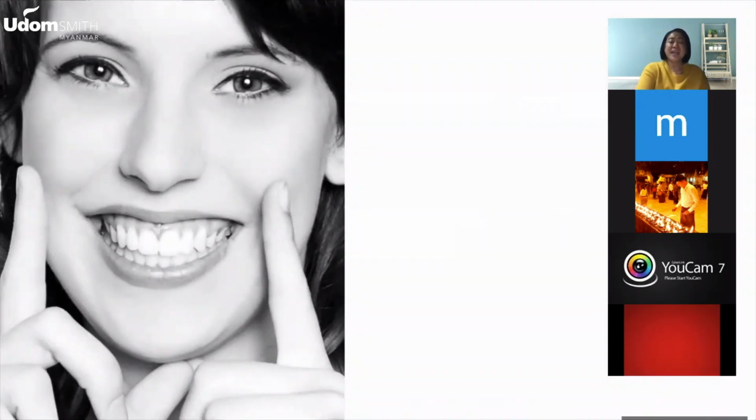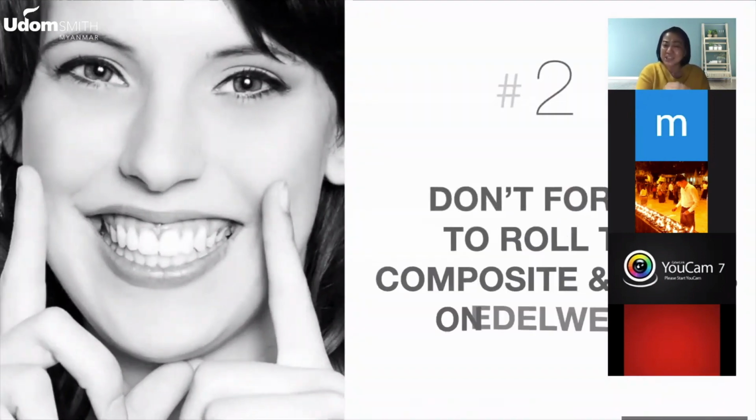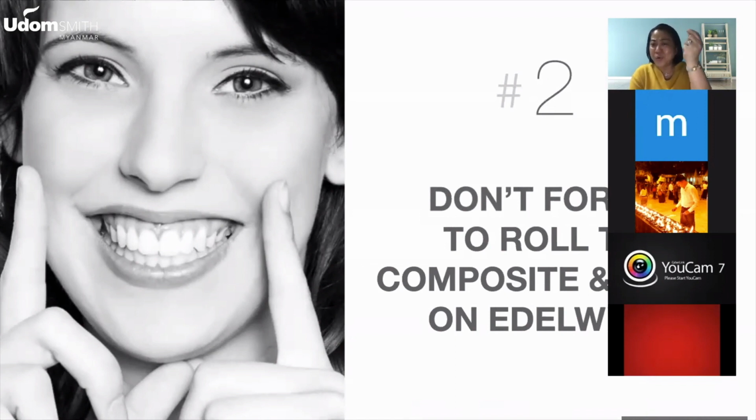Okay? Now, the next thing that you have to remember is always roll the composite. Rolling the composite before placing on the tooth is a very important part, not only for Edelweiss, but for direct restoration. Because when you roll the composite, it becomes compact and there are no air spaces in between.